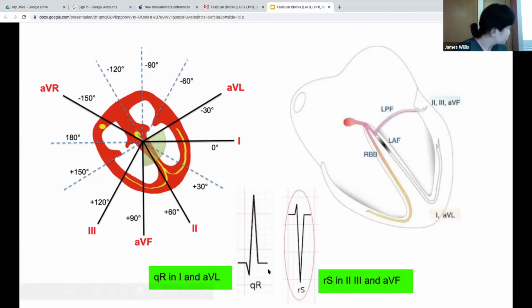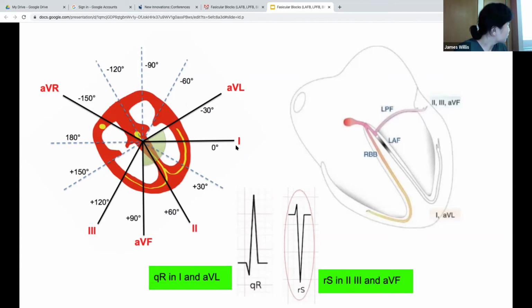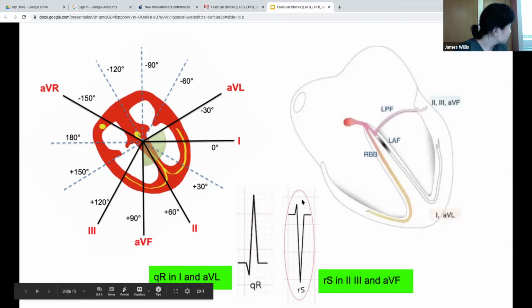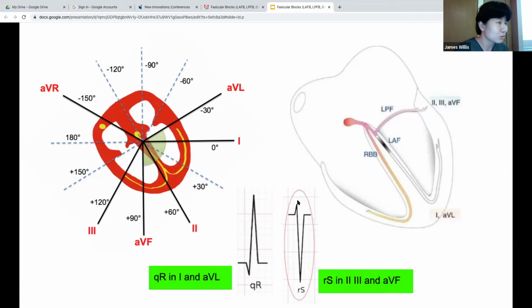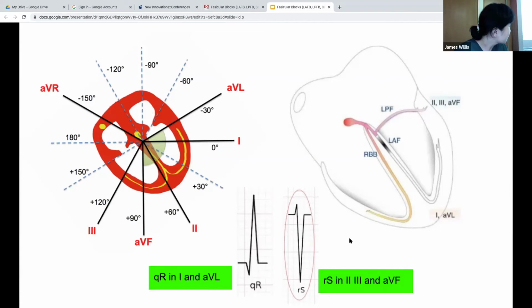And then it's essentially the same but opposite in the inferior leads in these guys, because you're initially going to have an electrical vector that goes towards these leads. So towards always makes a positive deflection. So you go towards it, and then you're like, there's a flood in the road, have to turn back around. And then you go away, and away is negative in the inferior leads.